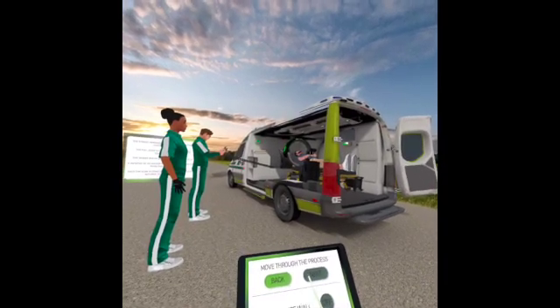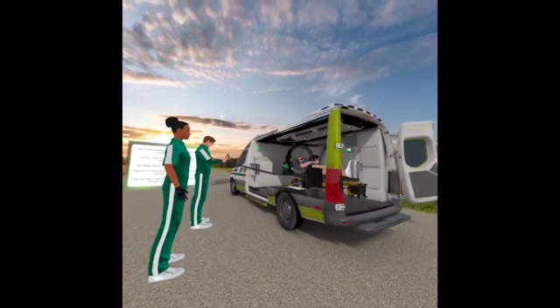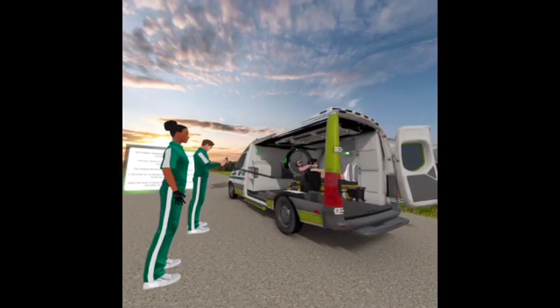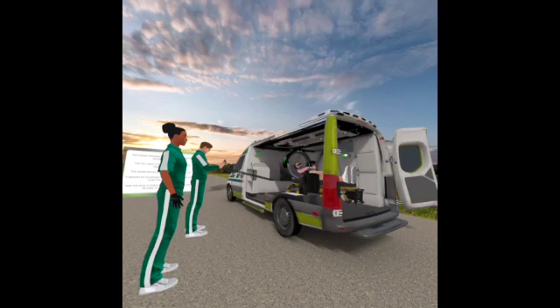They begin the scout scan to check image clarity and then start the full scan, notifying the teleneurologist. The imager assembly starts in the home position before rotating to the second and third positions. It automatically returns back to the home position.